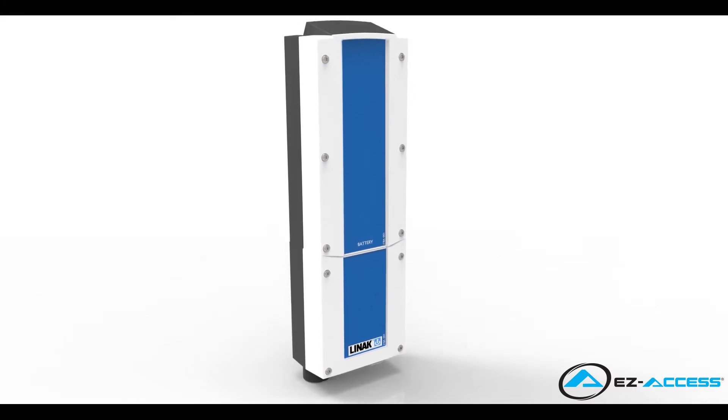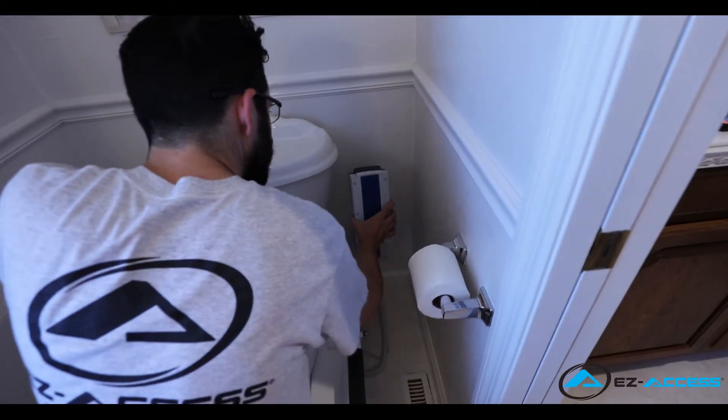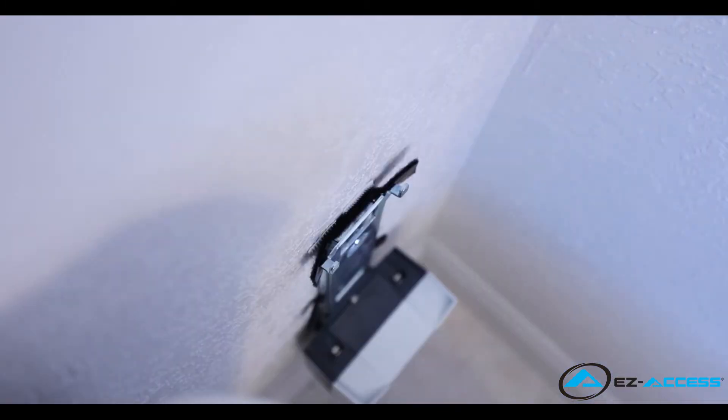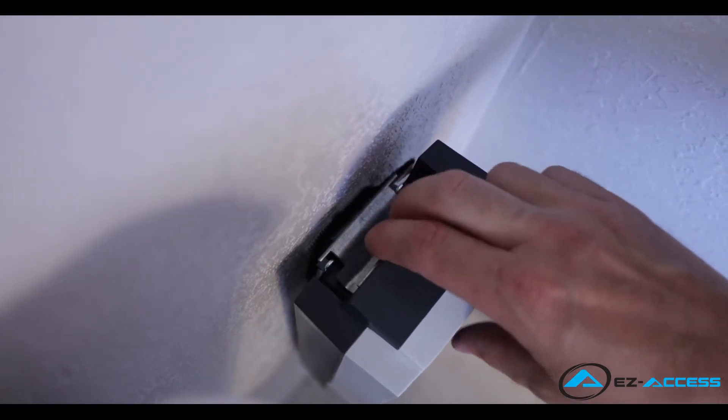To extend battery life, be sure to charge the battery whenever possible. To keep your tilt operational while the battery is charging, additional batteries are available. Once charged, reinstall the battery by sliding it onto the mounting bracket. The battery is in place when it rests on top of the control box and you hear the spring handle click into place.